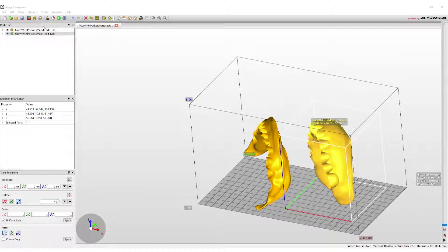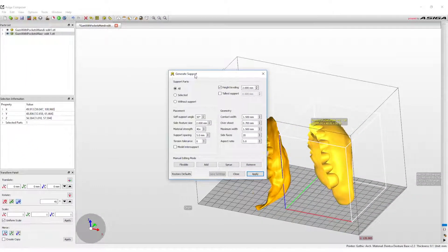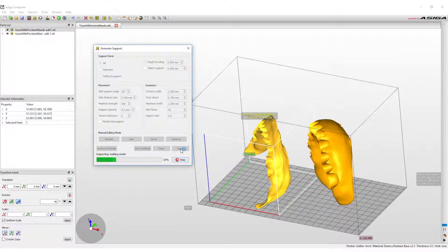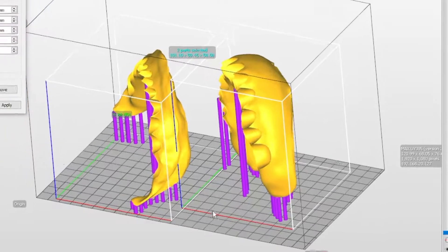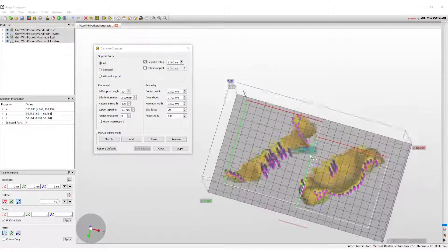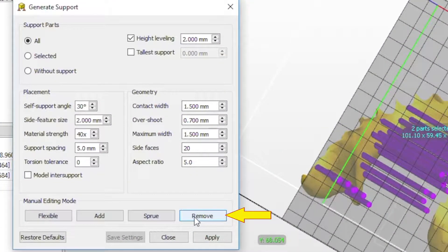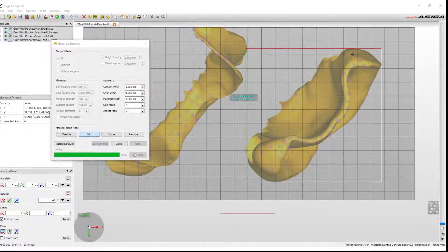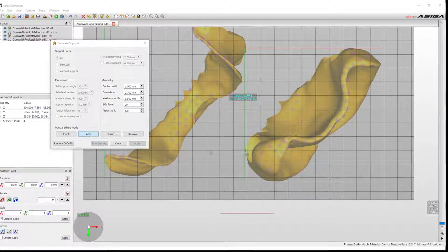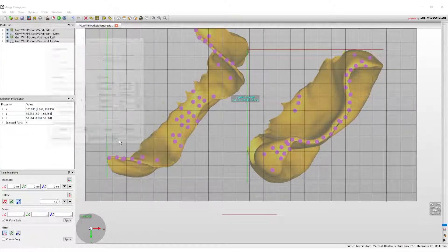The next step is to add supports to the denture base designs. In the upper toolbar, select the Generate Support option. The settings for this build are the same as the default settings, so just press Apply. For most projects, the default support generation placement will work well — it will locate all the overhangs that need to be captured to print the build properly. Sometimes automatically generated supports can interfere with tooth placement. To avoid this, click the Remove button in the Generate Support pop-up menu and click on the supports that need to be deleted. To add supports, click the Add button and click where the support should be added. Adding extra supports where the denture meets the build plate can add extra strength so the denture does not move or shift during printing. When satisfied, close the Generate Supports menu.